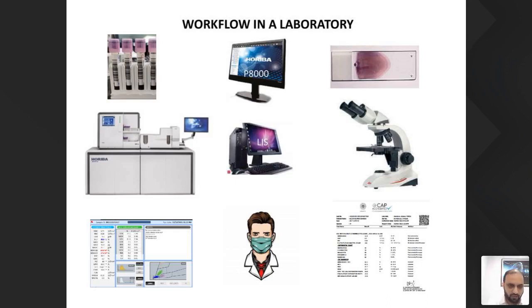In a standalone lab, 10 to 15% is a good enough criteria. In a hospital-based setting, it would be something more. But as we decide our slide making criteria, the slides are prepared, we view them under the microscope and we report it. This is the standard workflow almost across all the labs.